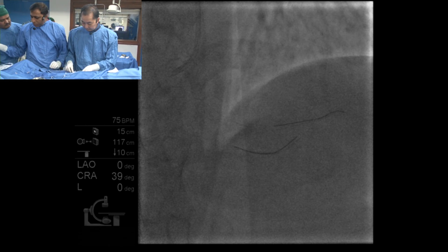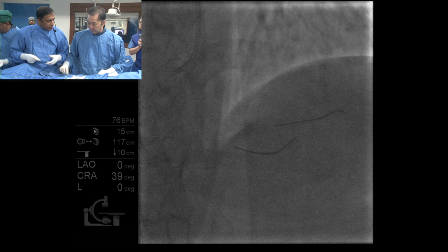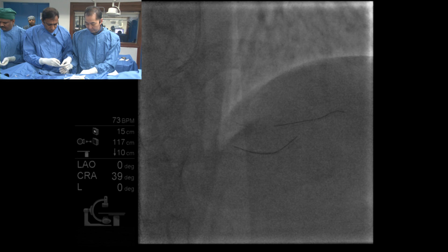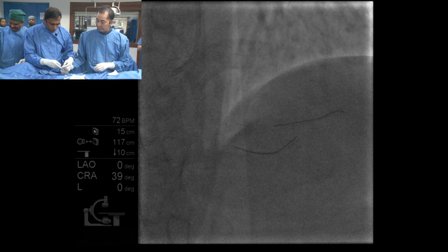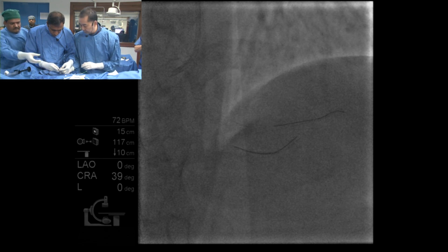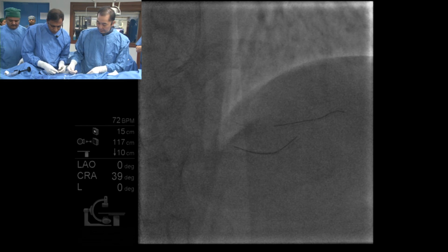So, Doc, this is Kintur. I kind of second the opinion of Aaron. We use the coronary Chocolate balloon, and it gives a very controlled expansion, very good luminal gain, and the risk of dissection is very, very small with this Chocolate balloon. We have seen that in below the knee disease, and we are seeing a similar thing in the side branch.